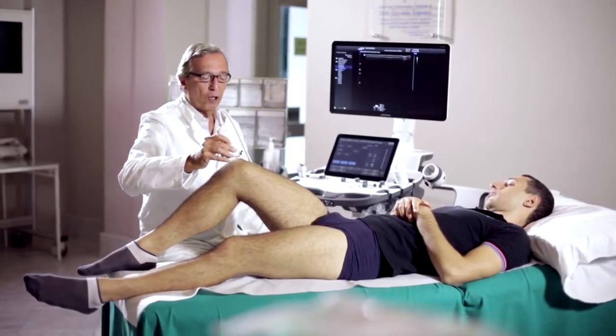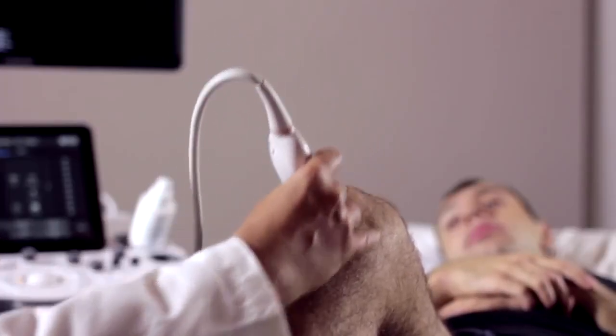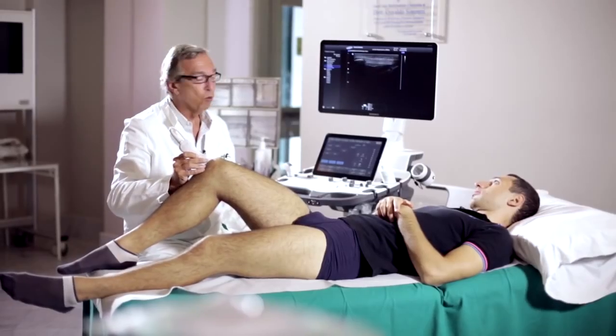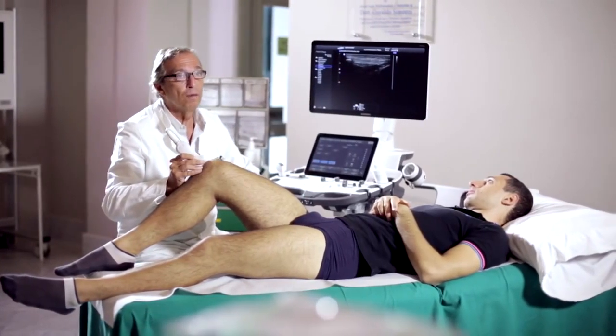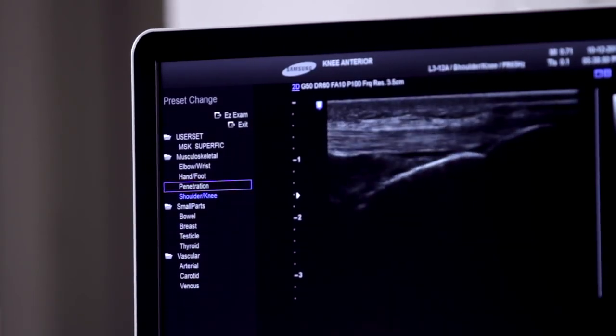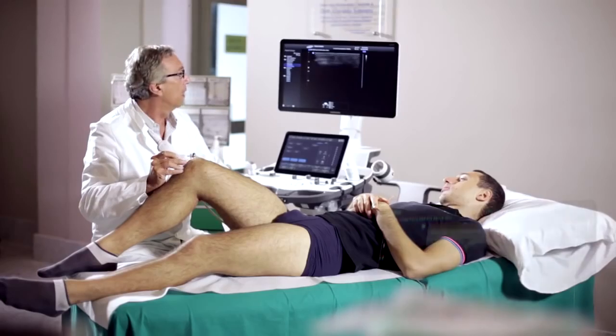Once this is done, we can move to analyze the tendinous component of the rotula, with a scan along the major axis of this tendon. We scan it starting from the lower pole of the rotula, on the left, and move up to its insertion at the distal end of the anterior tibial apophysis. This tendon may be studied very well using ultrasound scans.